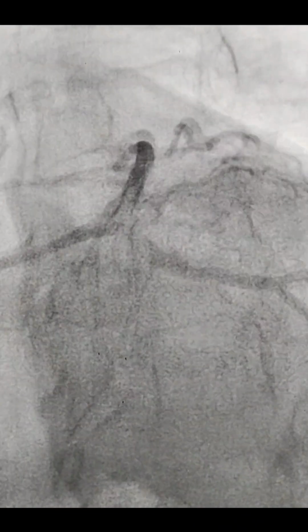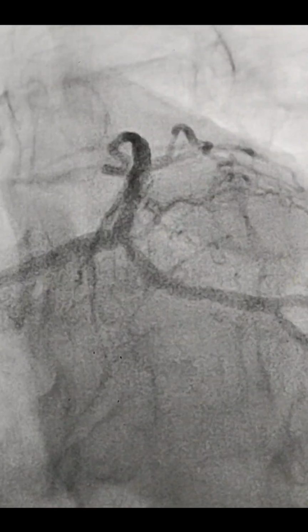So we did the predilatation with cutting balloon also to cut the calcium, and then somehow we got this result. The result was good. You can see in this LAD caudal view, the ostium of the LAD and the proximal LAD has opened up, and I think we cracked the calcium with this cutting balloon, and then this was a TIMI3 flow in the LAD.